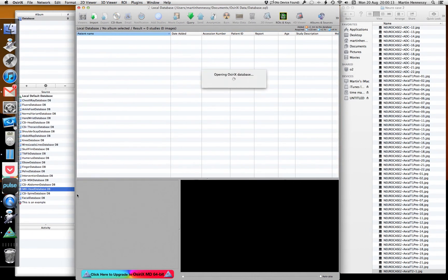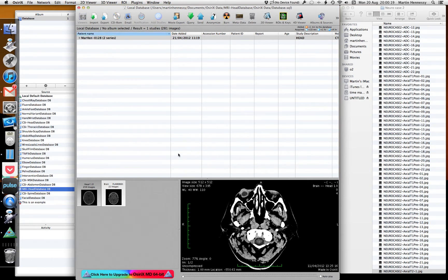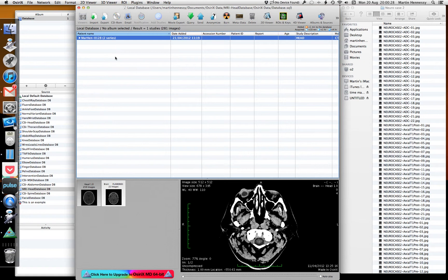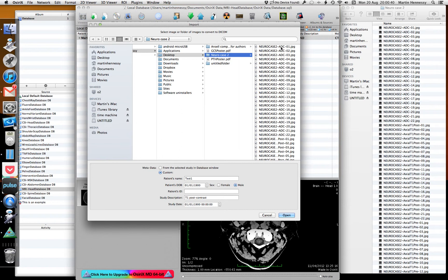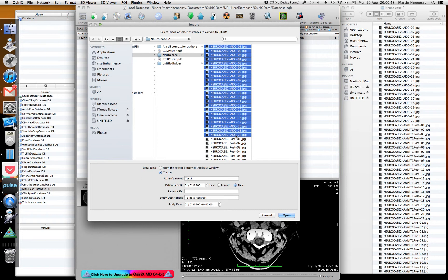I'm going to put this into a database that I'd already created, in the manner shown in a video on the website. Rather than using the regular import, I'm going to select Plugin > JPEG to DICOM. Everything is nicely laid out here so I know I can select all of the files.